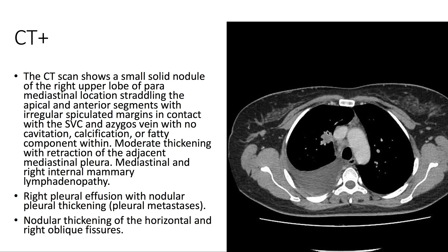It has an irregular spiculated margin, and the patient is noted to have mediastinal lymphadenopathy. There is a right-sided pleural effusion, and we see nodular pleural thickening.